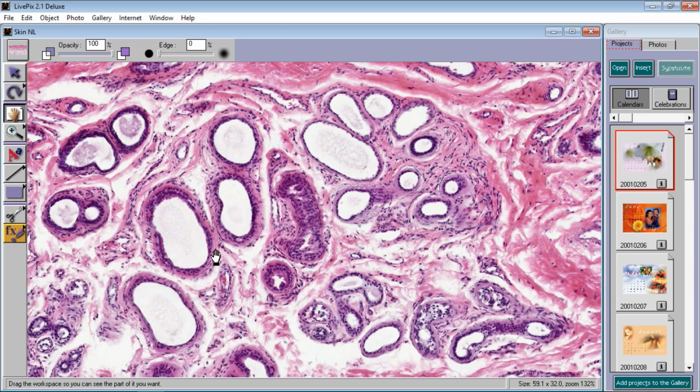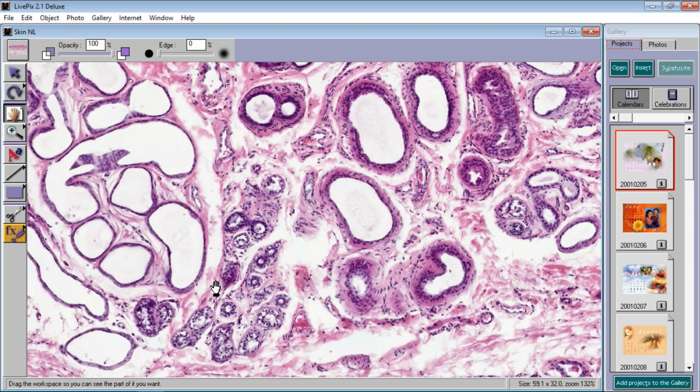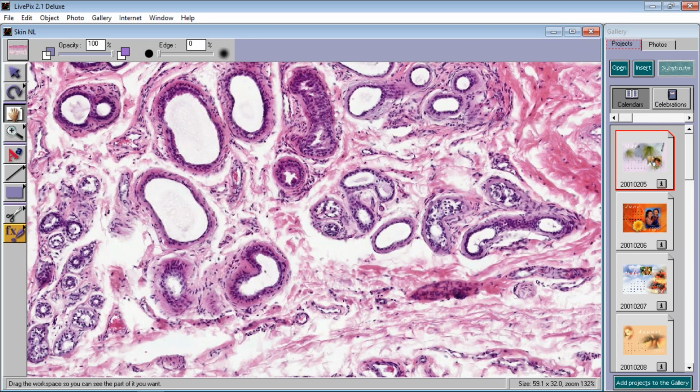They have more of a smelly secretion. That's why the worst parts of your skin to smell are your axilla and your groin area, because they secrete fatty substances, not just water like the eccrine glands do. By the way, here is an eccrine gland, and here's an apocrine gland. So big deal. So it's skin.